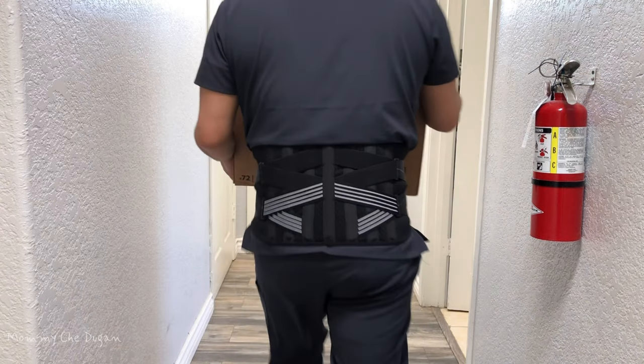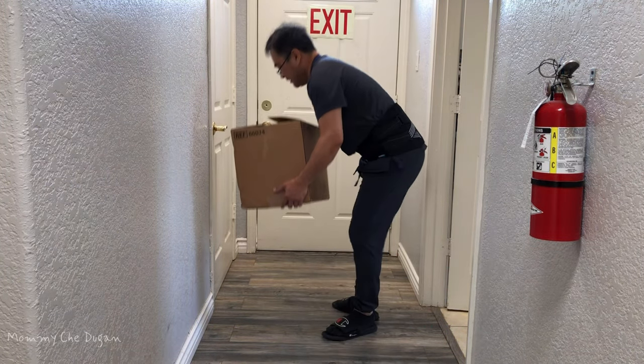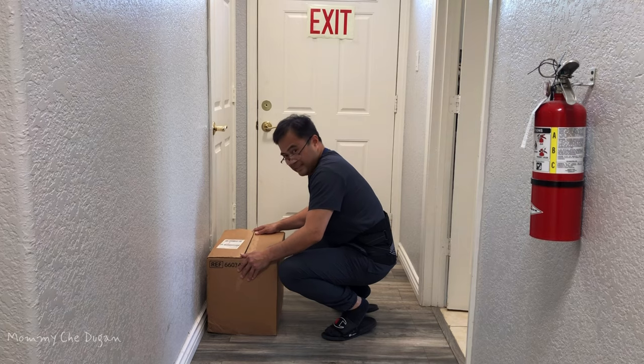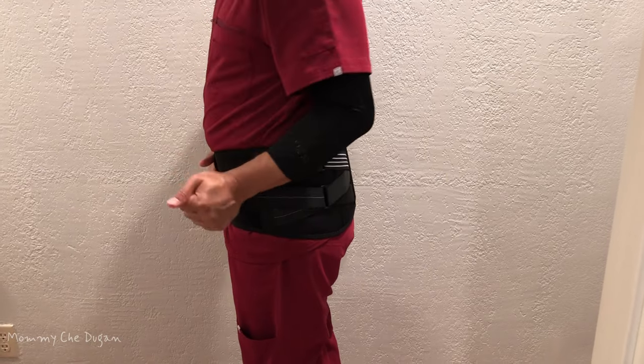This back brace features 4 shaped memory aluminum splints and 3 elastic tension straps which provide superior firm support for your spine without stiffness. The side spring stabilizer provides maximum support without loss of flexibility.